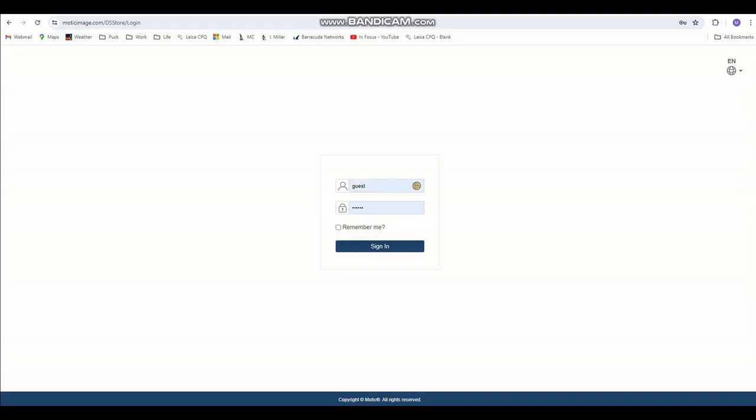It includes a comprehensive image viewer with annotation and presentation features, as well as the ability to manipulate, annotate, and do much more on your captured slides. It is easy to use and has administrative features to manage user rights and permissions.